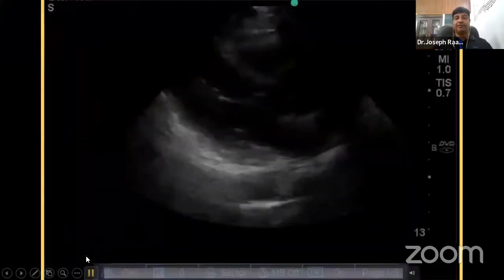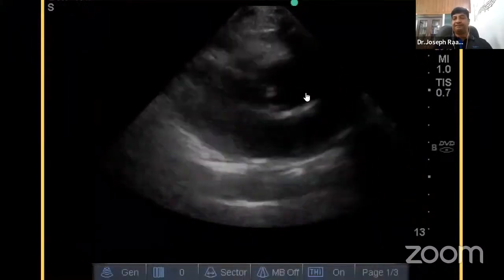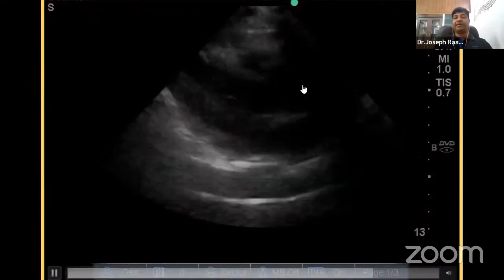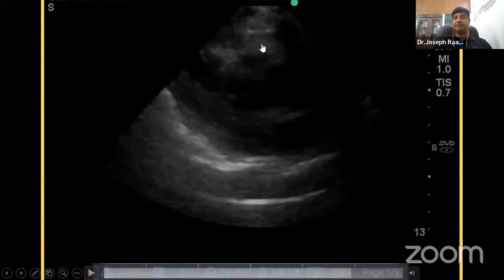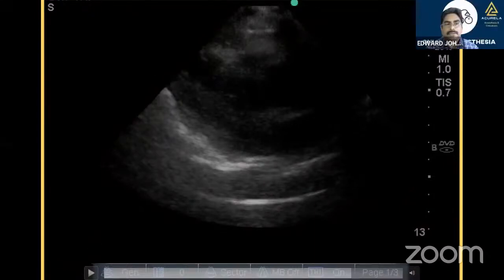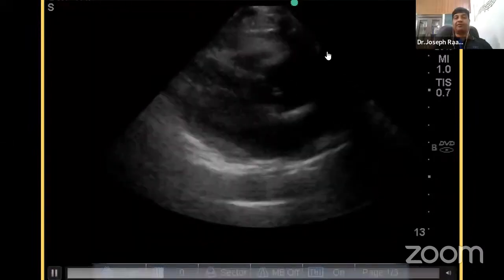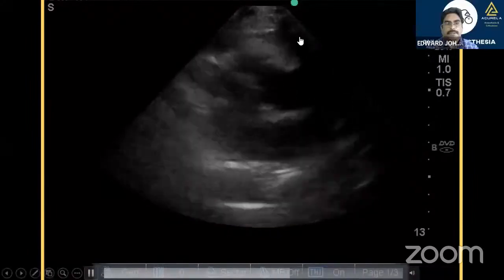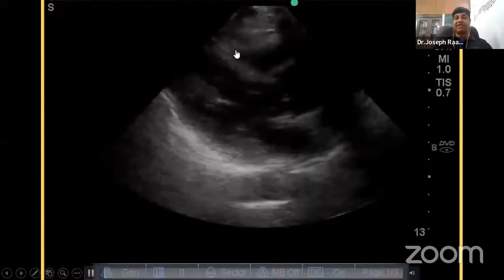First you need to tell me what this view is and what the abnormality is. Are you able to see the views, sir? Yes, sir. You can see the answers in the chat box. They are posting. If I open the chat box, my video stops. Oh, okay. They say it's a PLAX view. Very good. It's a parasternal long axis view. Very good.